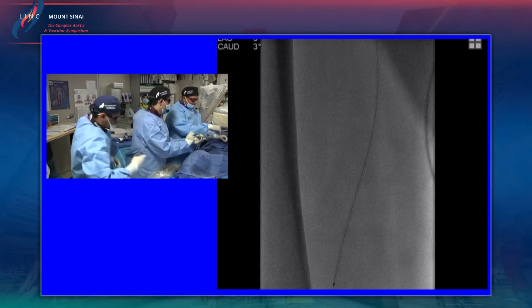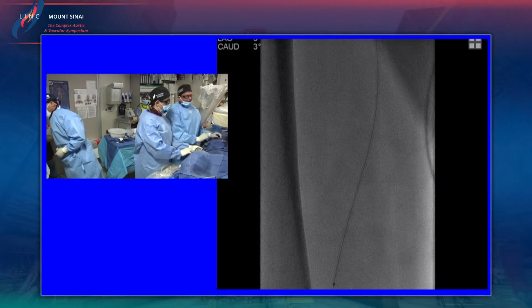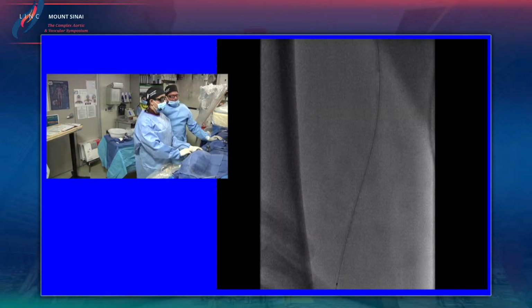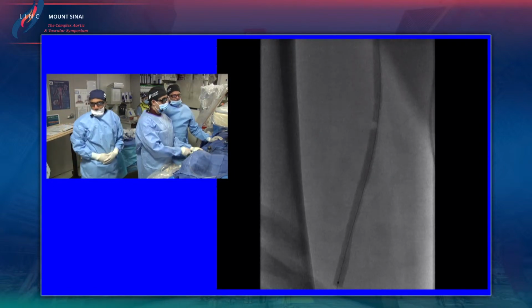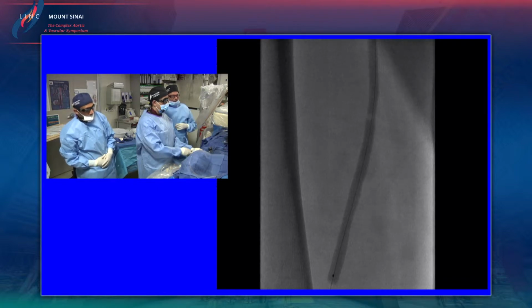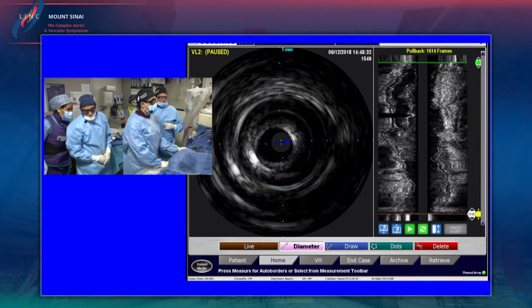I think that if I do embolize, Chris, and the panel, what I would do here is do the aspiration with the penumbra device, come forward, and or leave a lytic catheter or drip lysis. I think I'm ready to do that, and I think we have the expertise to do that. So at this stage, I'm going to go ahead and just go with a 6.0 chocolate balloon and just do balloon dilatation. I know it's longer than what Dr. Biamonino wanted, just because this lesion was completely occluded. At this stage you can see there's some atherosclerotic plaque there. So we'll leave this up, and then we're going to come back to you after the next lecture to show you how this turned out.